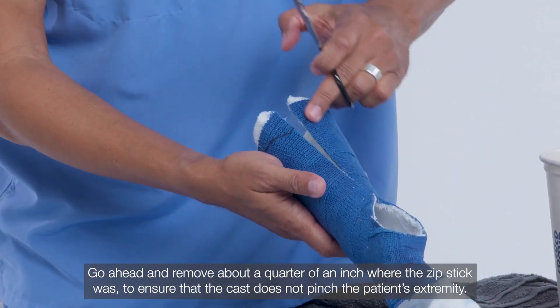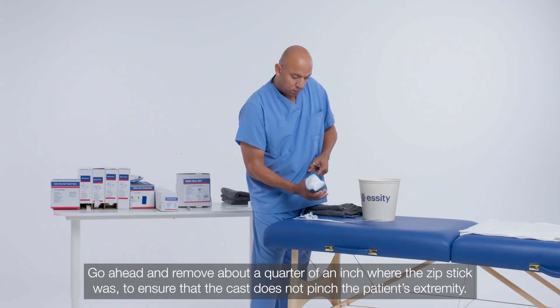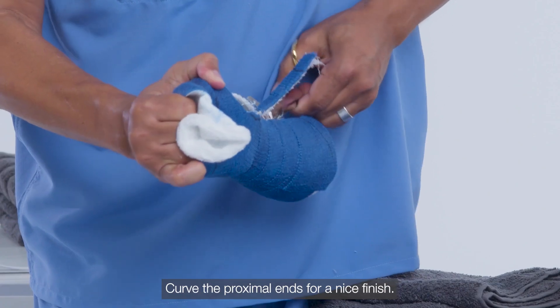Go ahead and remove about a quarter of an inch where the zip stick was to ensure that the cast does not pinch the patient's extremity. Curve the proximal ends for a nice finish.